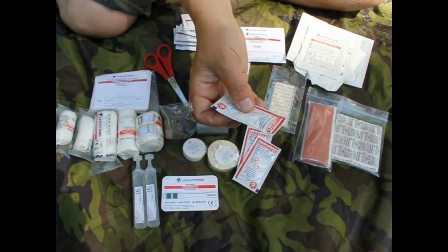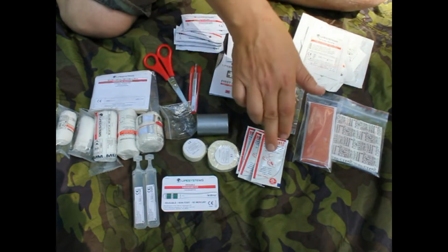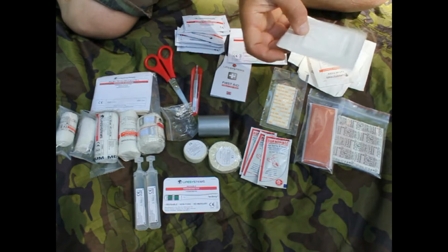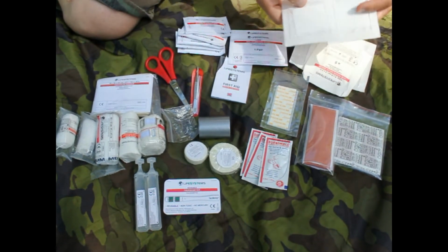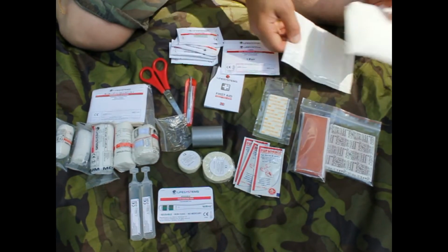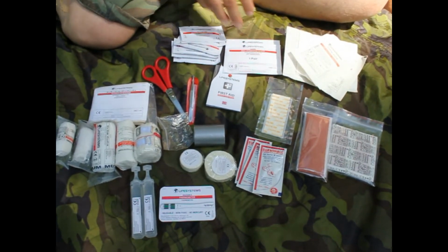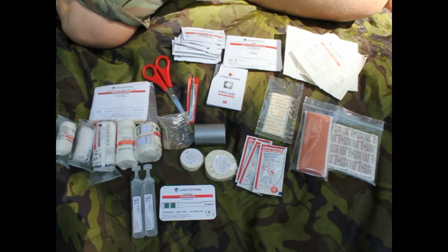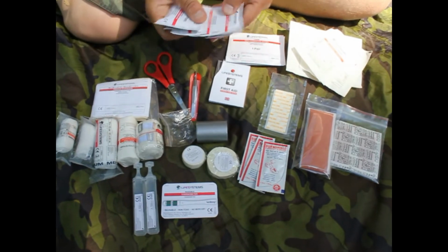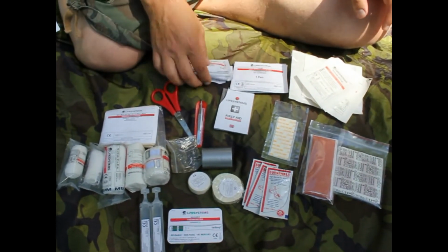Then you have these burn shields. If you get burnt, be sure to get some of these on. This will really help you. And also you have these larger pads here. If you have larger wounds, you can use the gauzes or the pads here and tape them up. Sterile, we have of course gloves here, and we have a whole bunch of these wipes. Actually, we have 6 of these wipes here, so that's nice.